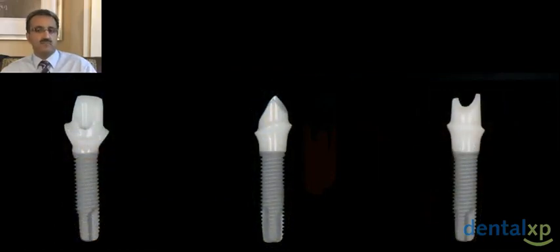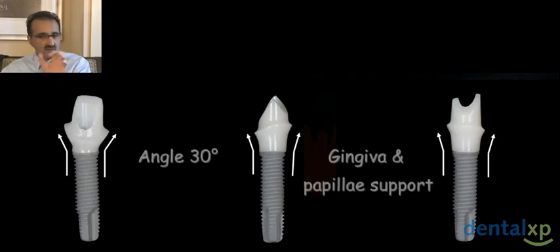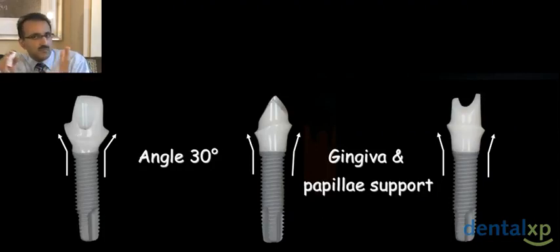So now we place our abutment in place, and we can customize that chair side. Maybe we need to just reduce a little bit of the volume labially to create enough support for our soft tissue, so we don't want too much blanching of the tissue, if any. And maybe we want a bit more support on the proximals, so we can have the lab just add a little bit of ceramic to that or modify it. And an easy way of doing it is to try in the resin abutment, the resin that they scan before they send it off. If you try that in, you can modify it and then have them scan it to the precise shape that you want.